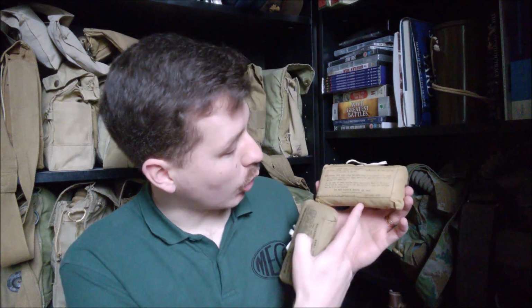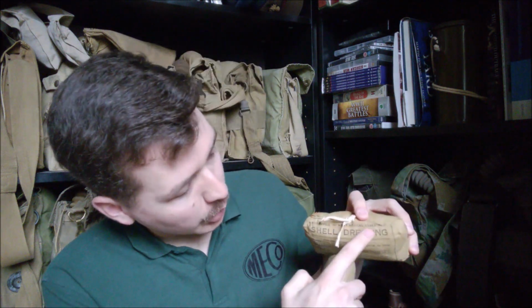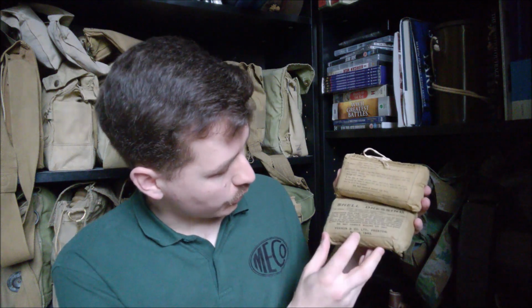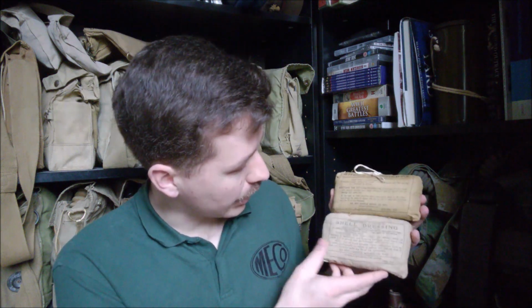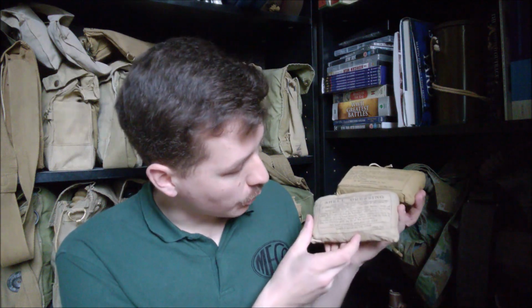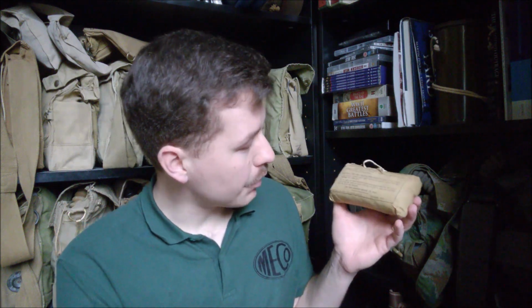This is actually a post-war British Army, so War Office, I don't know if you'll be able to see that, Army Medical Department, and it's dated October 1957. This is a wartime Admiralty one. It's the Admiralty there. And then August 1943, Vernon and Company Limited, Preston. They were made by other Commonwealth nations as well, Canada, Australia, and an Australian version here, by way of comparison, which of course I have for use with my Australian Vietnam kit. It's not uncommon to see these taped to the butts of rifles or to web equipment, and that's actually dated April 1942. The majority of these I have are post-war.